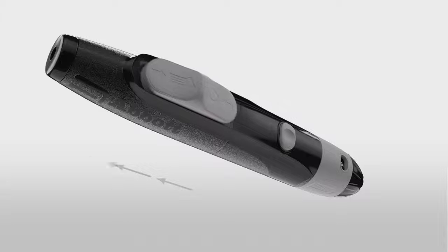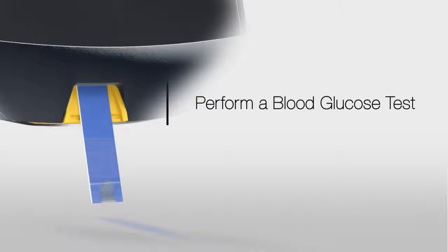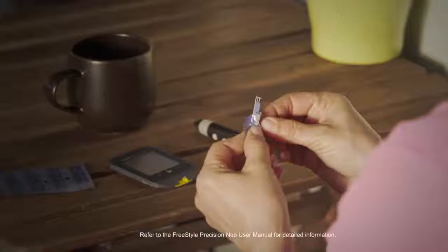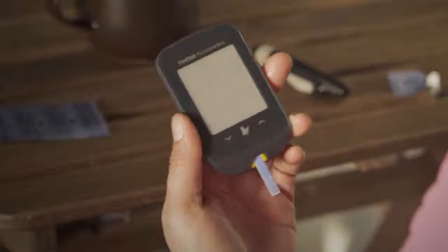Finally, pull the handle out until it clicks. You're now ready to perform a blood glucose test. Wash your hands well before performing a test. Open the foil test strip packet at the notch and tear down to remove the test strip. Insert the test strip into the meter until it stops — this will turn on the meter.